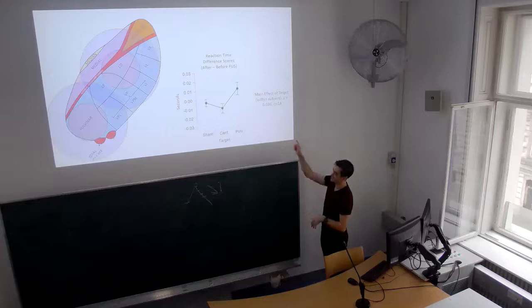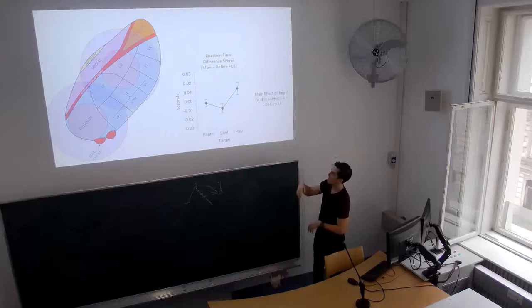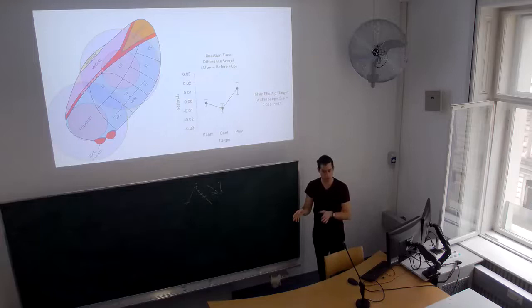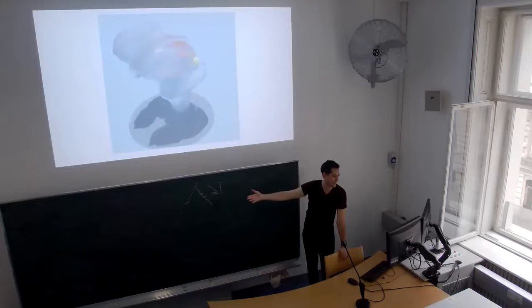And indeed, this is preliminary, but I am seeing differential effects between these two regions. This is a difference score in reaction time on a vigilance task. And the sham, you actually see nothing at all, but differential effects between the central and pulvinar thalamus. So if you're really good at this, if you know what you're doing, you can hit different parts of the thalamus, different parts of the caudate or putamen, hippocampus, but if you want to maybe hit the amygdala, you're going to hit the whole thing, unfortunately. So that just gives you an idea of the limitations here.